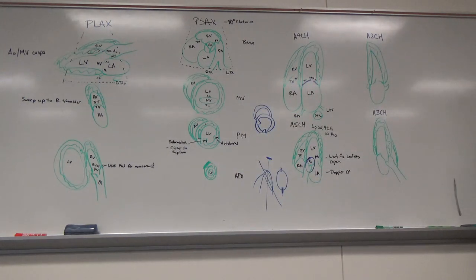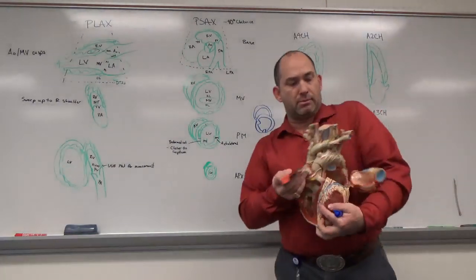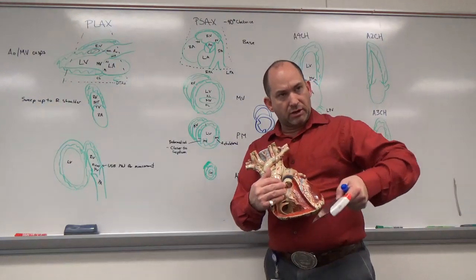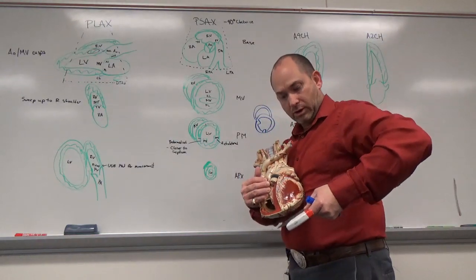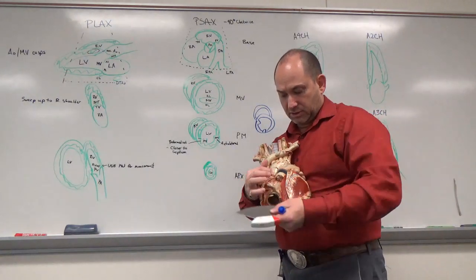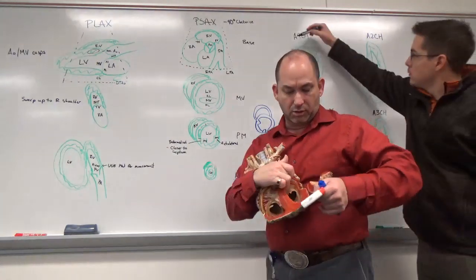So focus on getting that, and the issue that people have the most with getting this properly when they're scanning is, first of all, from apical perspective with our transducer, when I come to 4-chamber, the indicator is going to be towards the floor but tilted up just a little bit this way. So we're sweeping through there. 4 chambers here. We tilt anteriorly to see the aorta, which is behind this wall right here. So there's aorta. It's up inside here.